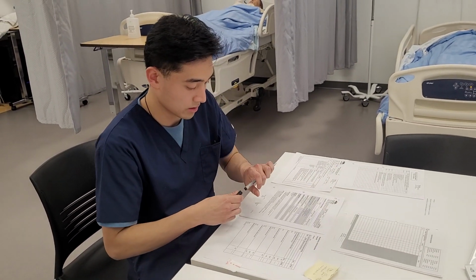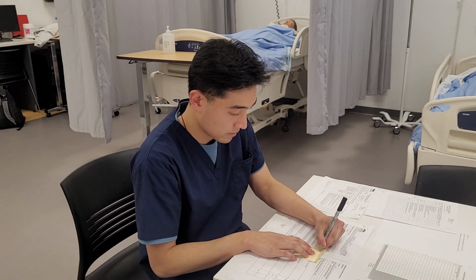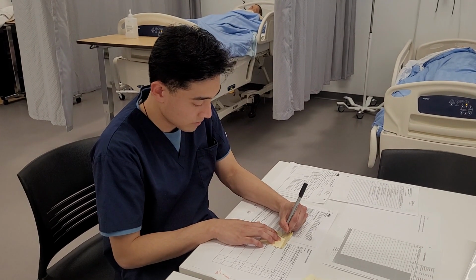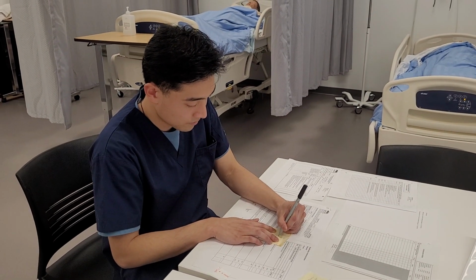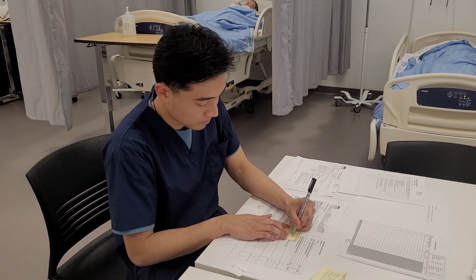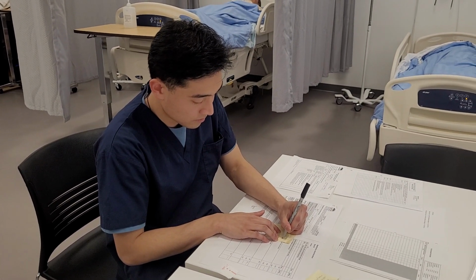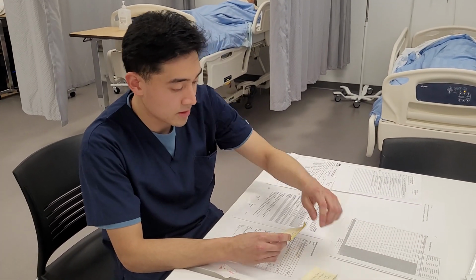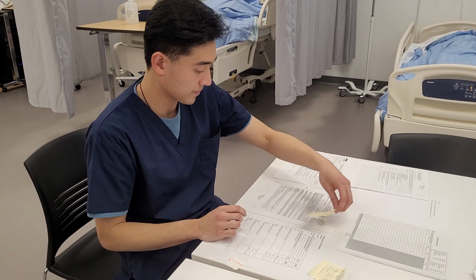So I'm going to do my calculations over here. 10 milliliters over 3 minutes. Alright, so the rate I'll be giving this medication is 0.83 milliliters over 15 seconds.